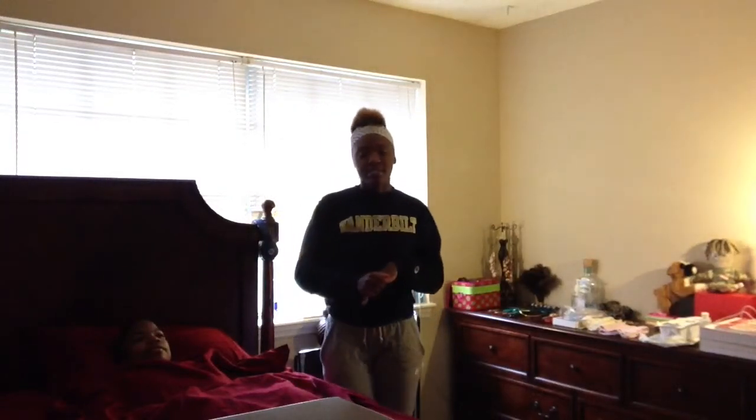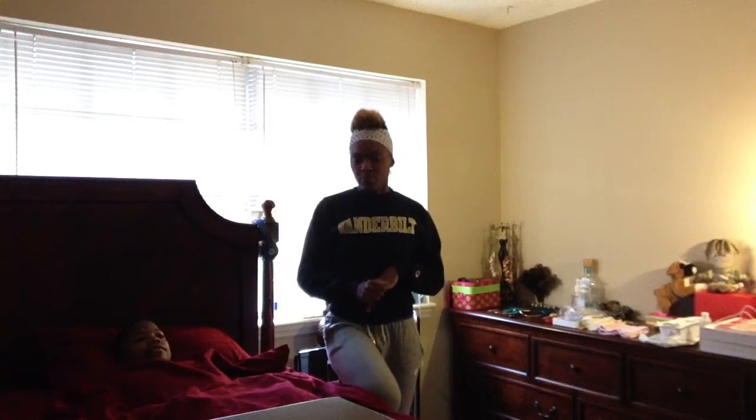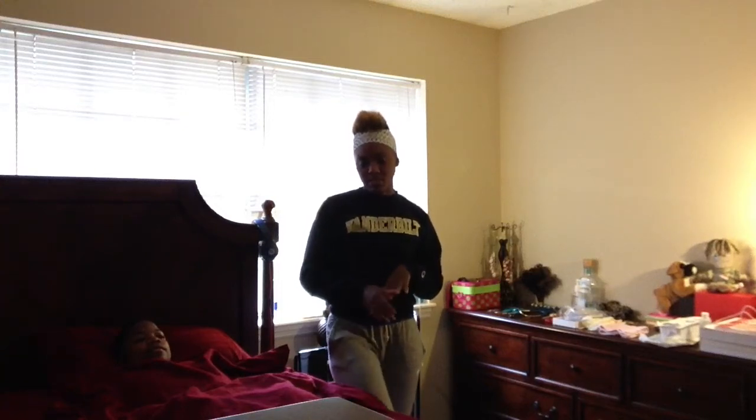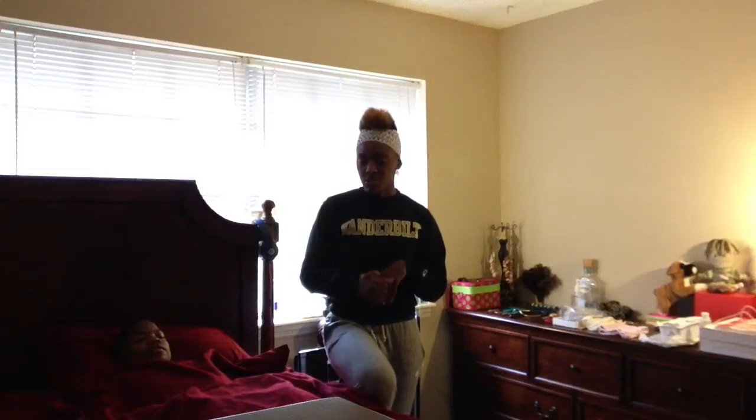My name is Matrice, and today I will be giving an enema. Before entering the patient's room, I want to check the doctor's orders. I'm going to check for any fecal impaction, and that's going to let me know what type of enema to use. I'm also going to check for consent because it is an invasive procedure.